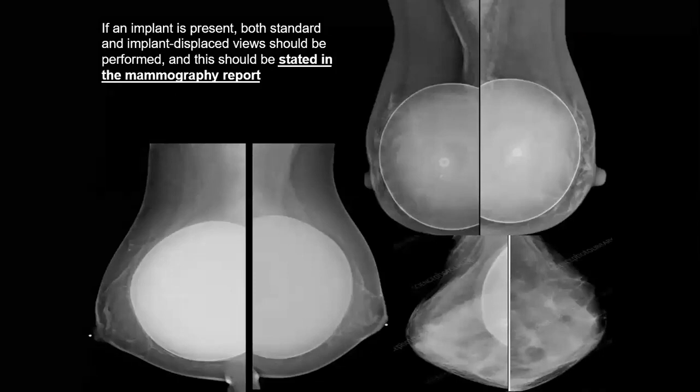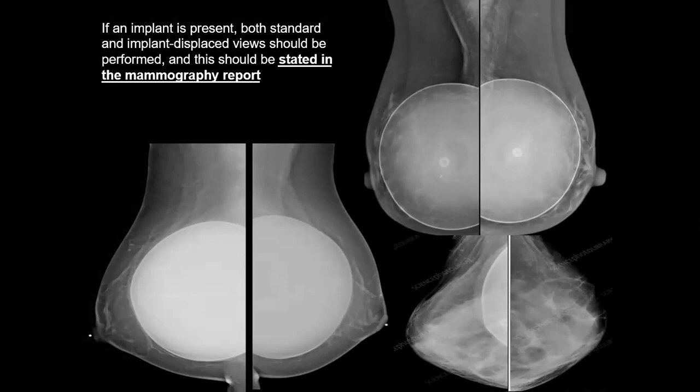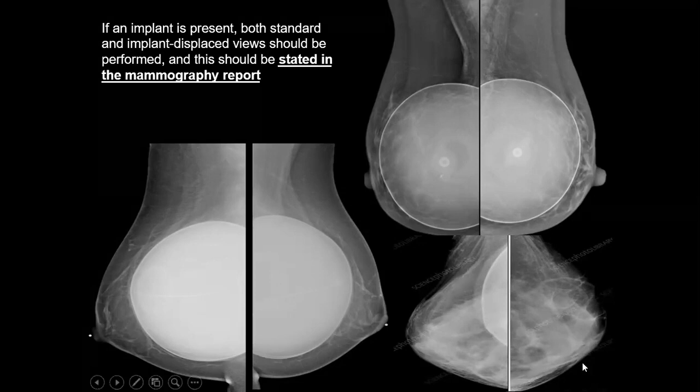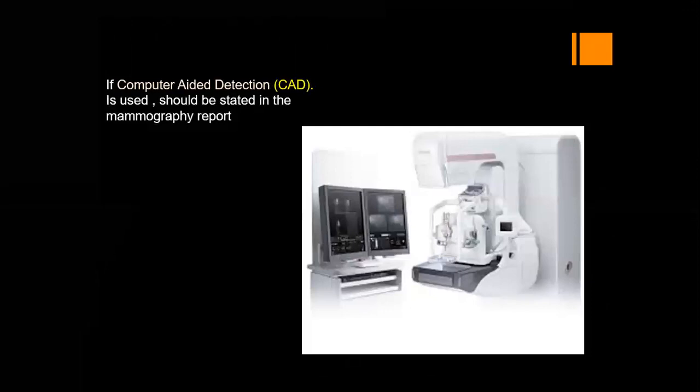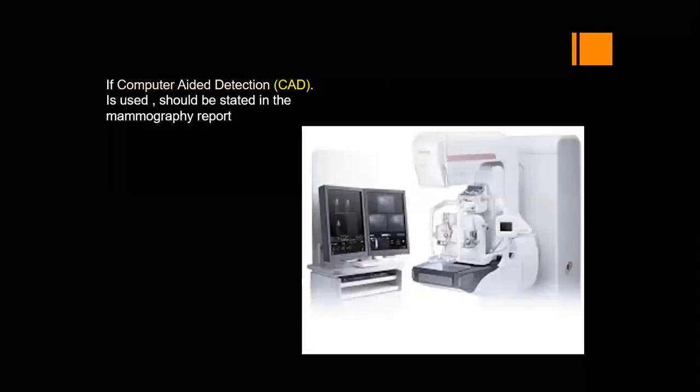And if the patient has an implant, we have to remember to do both views, the implant in place and the implant displaced view, or the standard view with the implant in the normal place, then the technician pushes the implant inside and pulls the breast parenchyma forward, like in this view, so we could see most of the parenchyma away from the implant to look for any hidden lesions. And this should be stated in the mammography report. And if you use computer-aided detection for the mammographic evaluation, it should also be stated in the report.